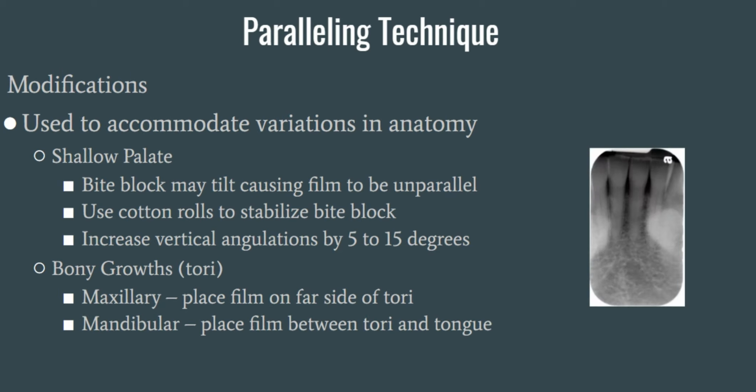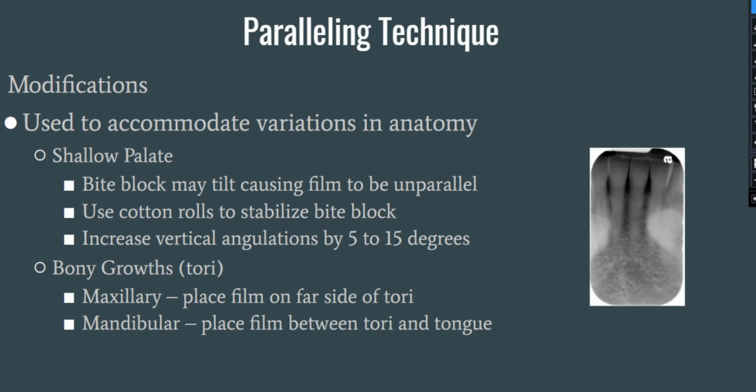And so here's just a little example. You can see that film in this area right here. You will notice that radiopacity, and that is going to be tori.